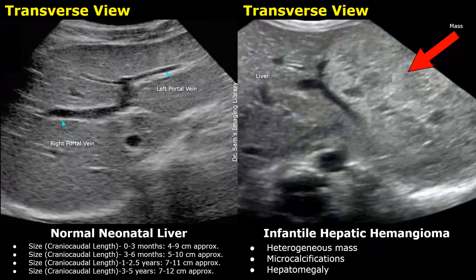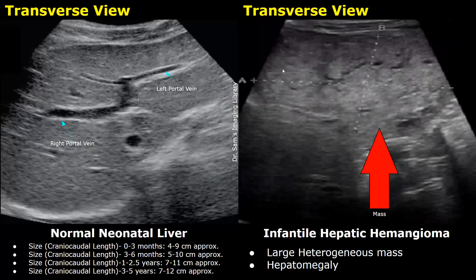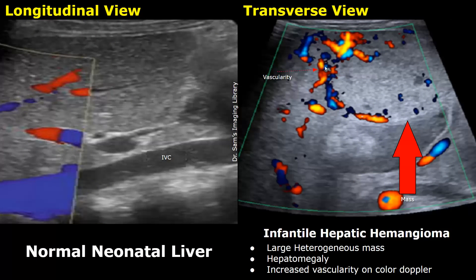A hemangioma occurring in infants is given the term infantile hepatic hemangioma. In this case, there is a large heterogeneous hyperechoic mass in the liver with some microcalcifications, and hepatomegaly was observed. In another case, a large heterogeneous mass is seen in the liver, again with hepatomegaly. The hemangiomas will show increased vascularity on color Doppler.